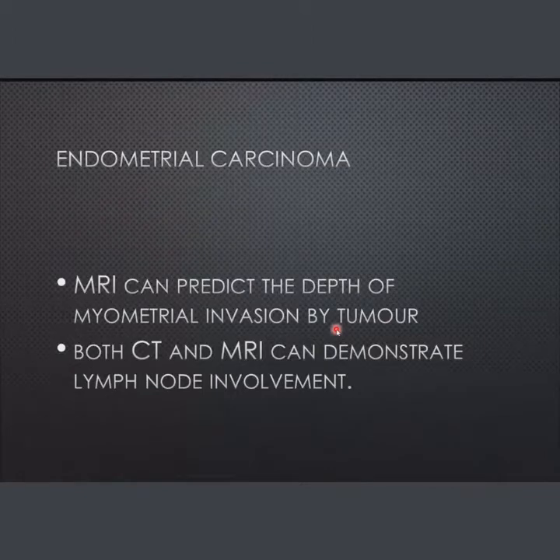Usually bleeding. وبالأخص postmenopausal bleeding لأنه usually uterine carcinoma is diagnosis in postmenopausal patients. For postmenopausal lady with a bleeding will be evaluated by ultrasound. ليش؟ لأن ultrasound راح نقيس بيه endometrial thickness. إذا endometrial thickness is normal, okay. There is no risk that this patient have endometrial carcinoma.